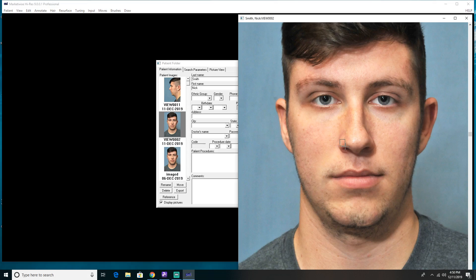I'm going to start with a little box, which is unusual for me — I usually use big boxes first — but I wanted to move around some of these shadows very delicately. I'm going to make a slightly bigger box. I'm only putting in the box the area that I want to move. Everything in the box is going to move, so you have to be careful not to choose areas you do not want to move, like the ala. I'm moving these areas slowly and we're getting pretty close to the shape. Now I need to work on the shadows up here. The morph addresses the basic shape. Now I'm making a box around the shadow on the dorsal and pushing it out.